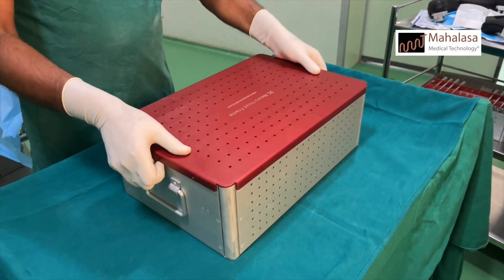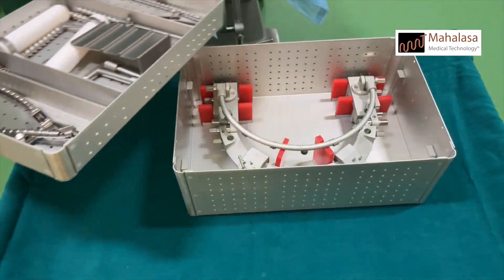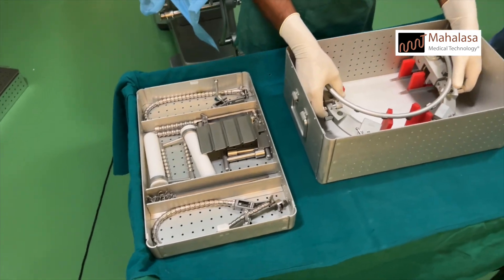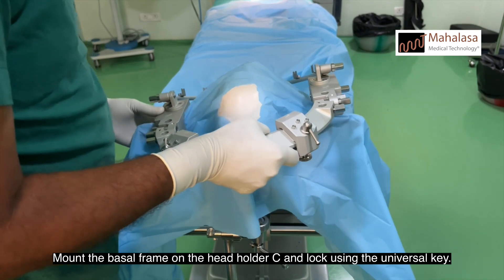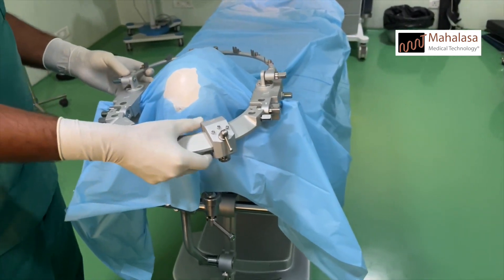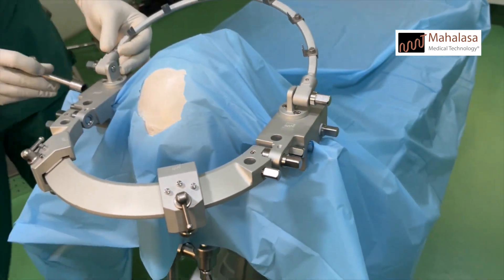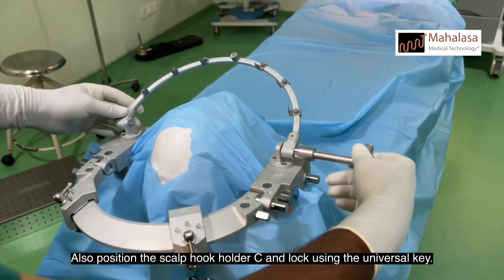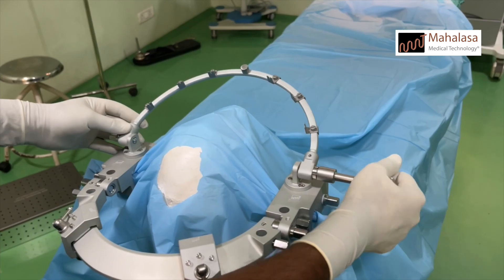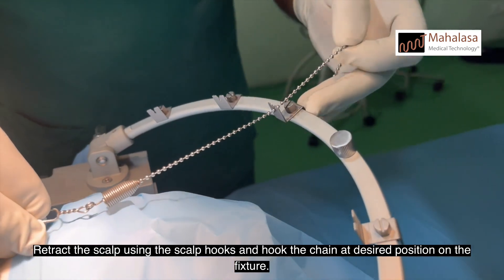Open the basal frame sterilization box. Mount the basal frame on the head holder C and lock using the universal key. Also position the scalp hook holder C and lock using the universal key. Retract the scalp using the scalp hooks and hook the chain at the desired position on the fixture.